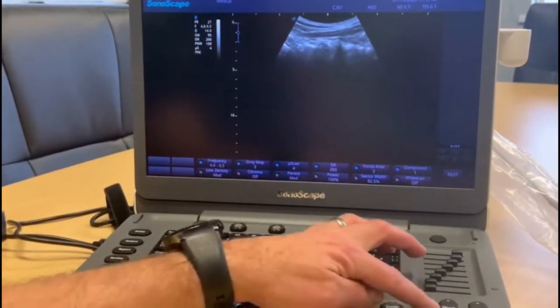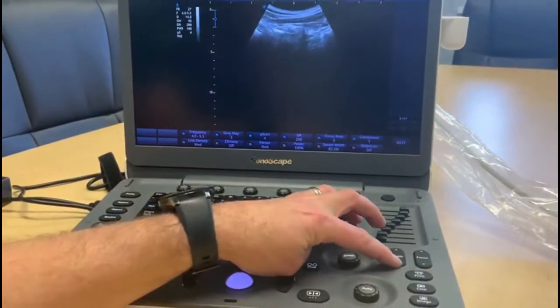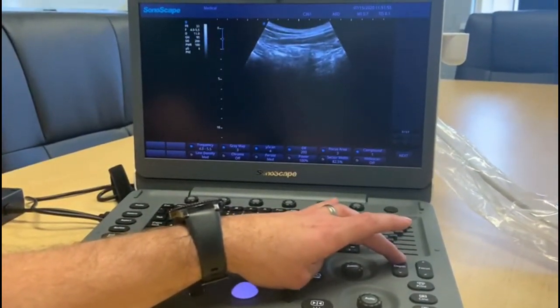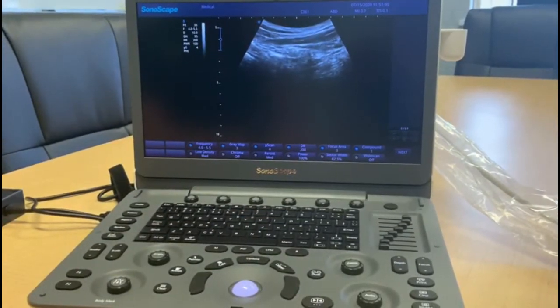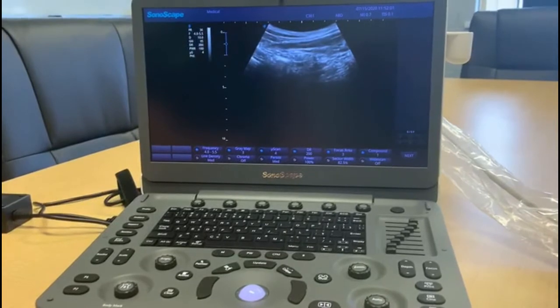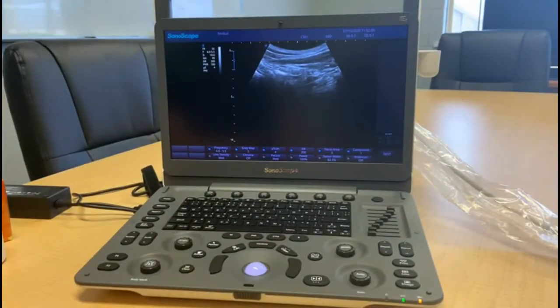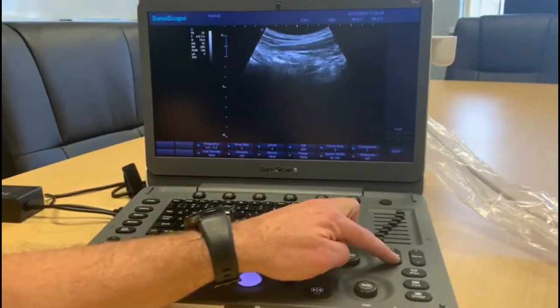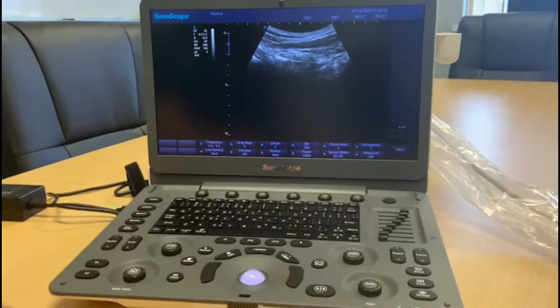Moving on, we have depth of screen. We can adjust what depth we want to look at — you can see it increases and improves the size of the image. This is not a zoom; this is telling the machine to picture deeper down. It gives a much better image, although you do lose a bit of clarity, so it's a little bit of juggling around with the blacks and whites.